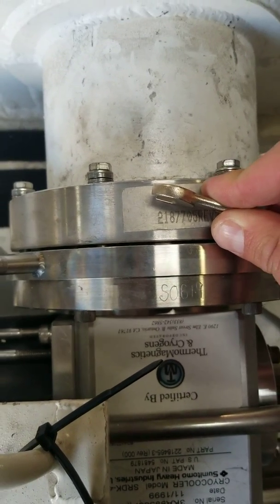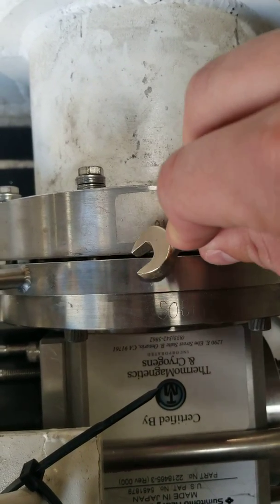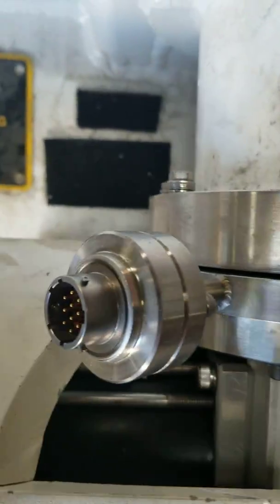We want to evaluate whether or not the cold head was put in straight. It's this spacing here, that space. So we look around the cold head and we make sure that it's even all the way down, and we make sure it looks even and straight, not tilting from one side to another. So that's the first part of the evaluation.